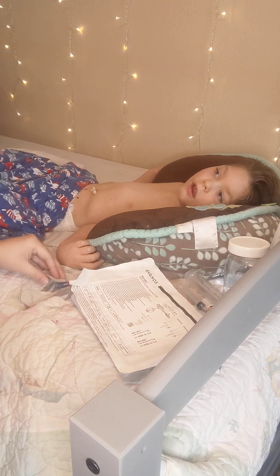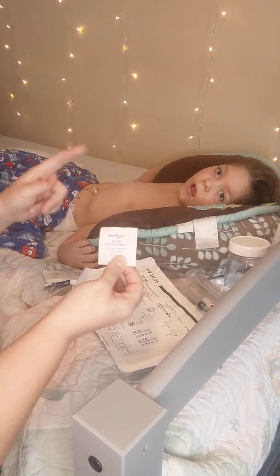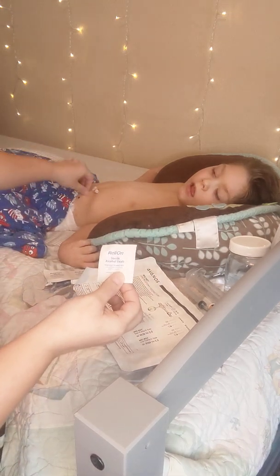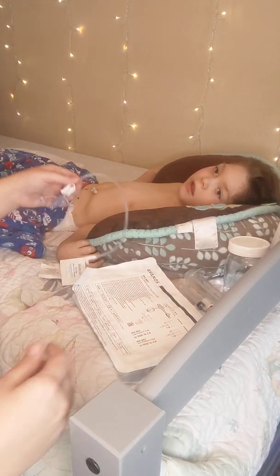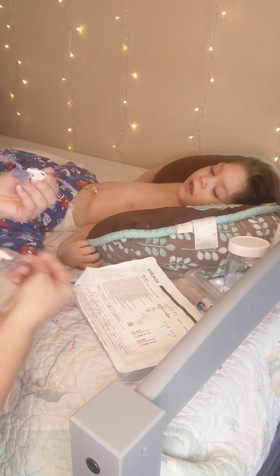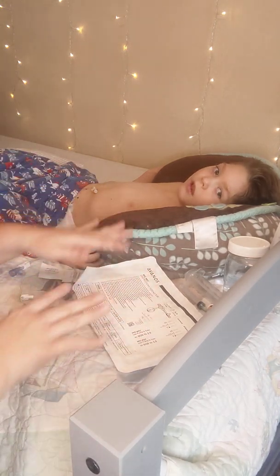And a couple of extra things that I use. Of course, I have clean hands anytime I do this, but I also pre-clean the area before I take his button out, which I'll go over. So you'll want some alcohol. If you have swabs or cotton balls and alcohol, it's fine. I have his extension I've been using. Like I said, it comes with one, but I just grab the one I've been using and save that as a spare.